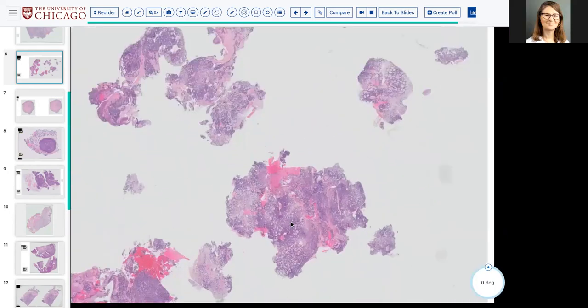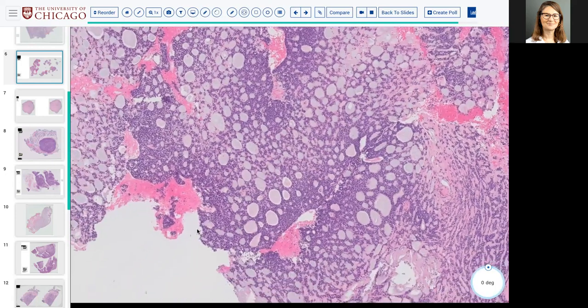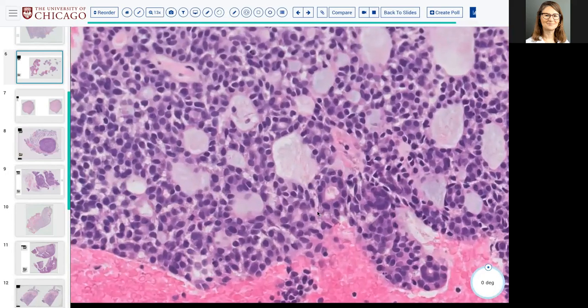Yeah, I think it maybe means that they're not open to the outside world, or that the quote unquote lumina of an adenoid cystic aren't really secreting anything into them, perhaps. This is an area composed of epithelial cells, but they're not really making any product that they're secreting into this quote unquote lumen. They're just there, and you can highlight them on c-kit immunostains and find that they're different from the myoepithelial layer. So in that regard, perhaps that is what they're trying to say. Yeah, that seems reasonable.